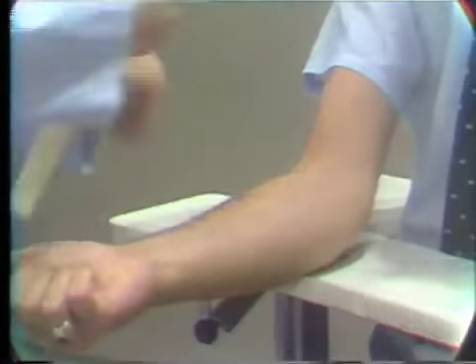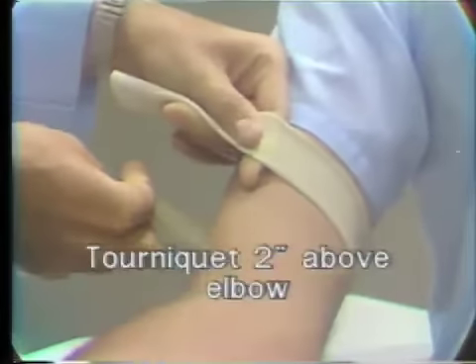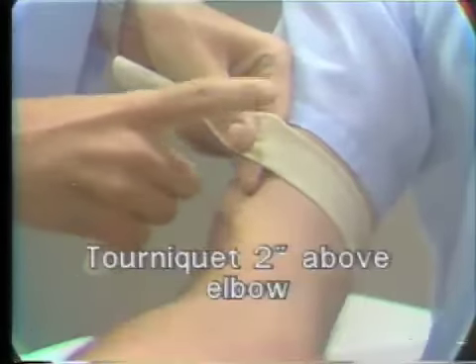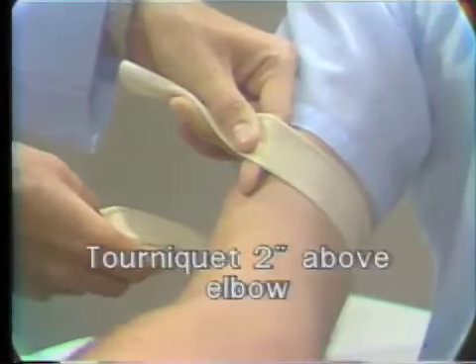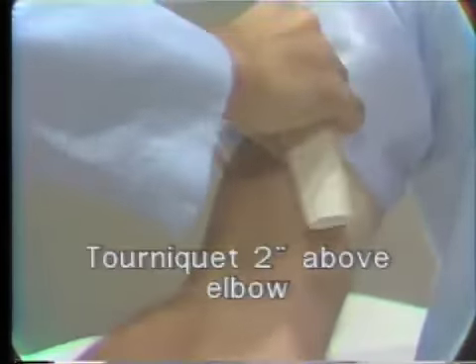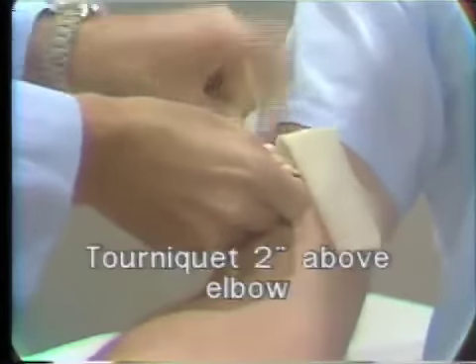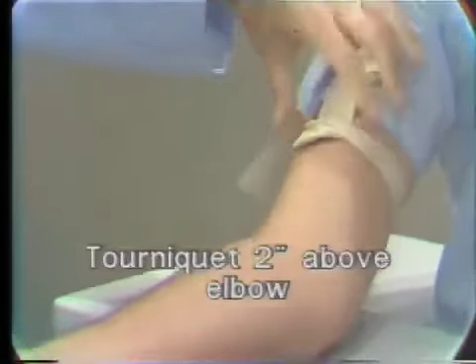Proper application of the tourniquet is very important. The tourniquet should be placed for maximum use during the venipuncture, but also for comfort for the patient. One method of making it more comfortable is to put your finger underneath the tourniquet so your finger is between the patient's arm and the tourniquet, pulling just the right arm tight to make the tourniquet tight, tucking it up under by lifting the tourniquet away from the arm and then releasing it back down. What this does is makes it so you don't pinch the patient.